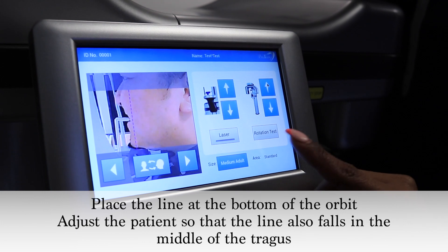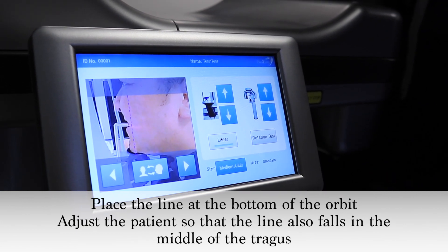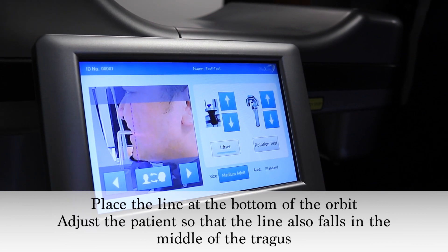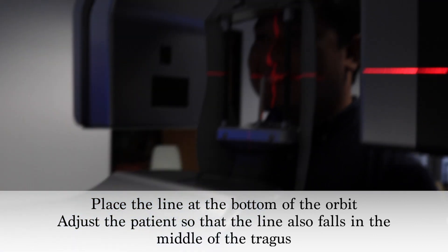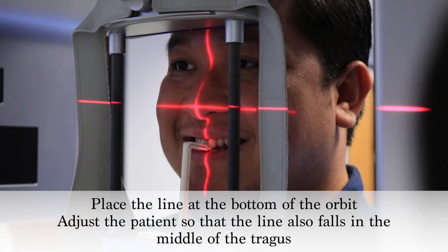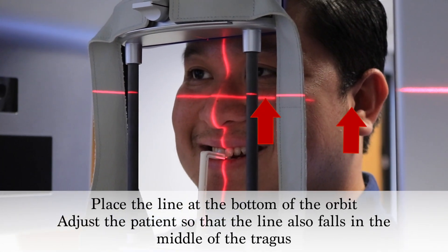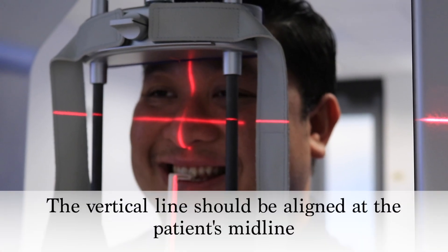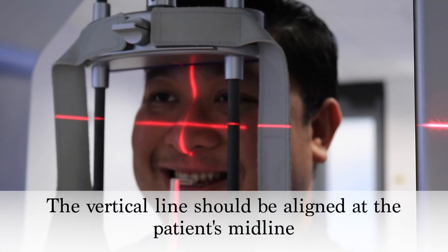Select the laser icon and adjust the horizontal line so that it is positioned in the middle of the tragus and bottom of the eye orbit. Also verify that the vertical laser light is properly aligned at the patient's midline.